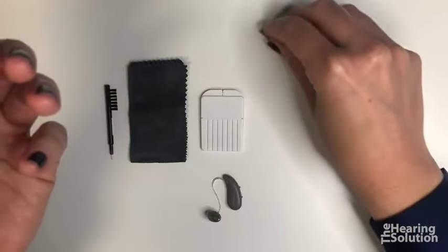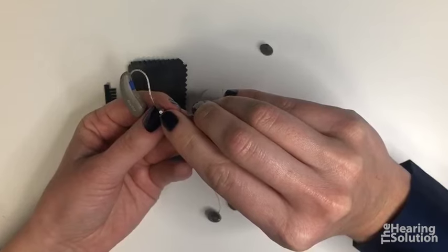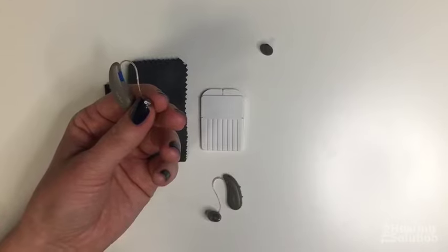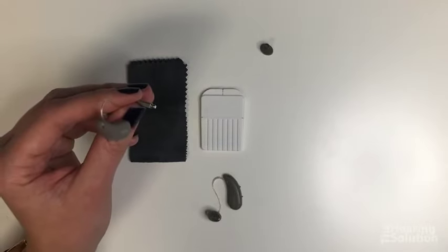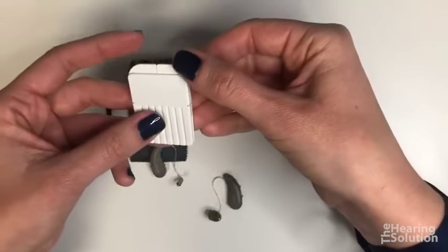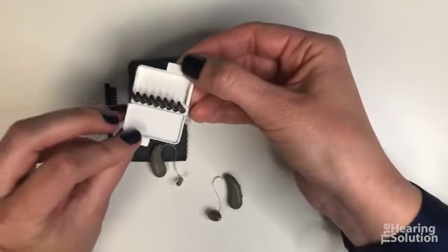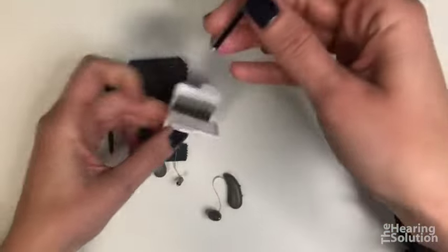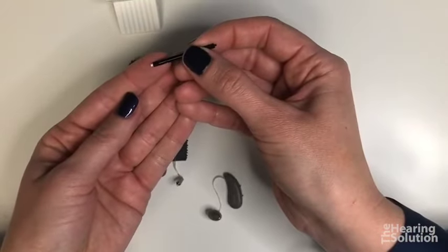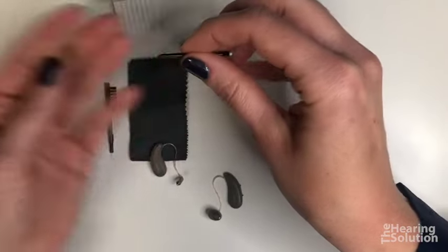But before we put the new dome on, we want to check your wax filter. That little white piece right there is a little filter that's going to capture any wax before it gets down inside of the speaker and damages the speaker. So what we'll do is take your wax filters. It opens up by spreading the two tabs, kind of like a coin purse. You'll take one of these sticks out of the package. On one end, you have a brand new wax filter. On the opposite end, it's almost like a little screw.